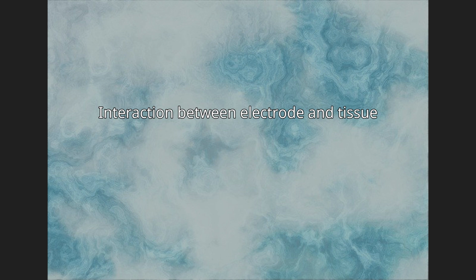Common materials for electrode or probe construction include silicon, platinum, iridium, polyimide, ceramic, gold, as well as others. In addition to the variety of materials used, electrodes are constructed in many different shapes, including planar shanks, simple uniform microwires, and probes that taper to a thin tip from a wider base. Implantable electrode research also employs many different techniques for surgically implanting the electrodes.